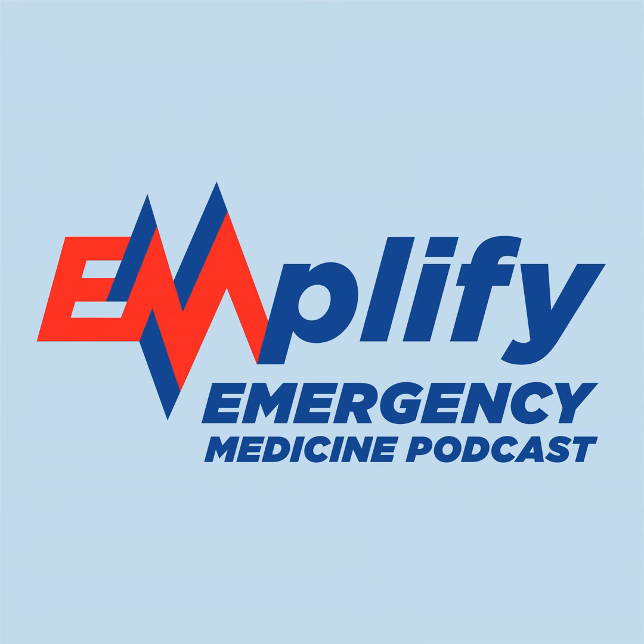Next on the list was inspiratory and expiratory ratio. So this is the amount of time the ventilator spends giving you your breath and then allowing you to exhale. And where are we on those options? So the I to E ratio, or inspiratory to expiratory ratio, just tells you how much relative time is given to inspiration, how much relative time is given to expiration. And although on some ventilators you can actually adjust that directly, there's no way to defy the laws of physics. And so really it's going to be mostly based on the respiratory rate that you choose.